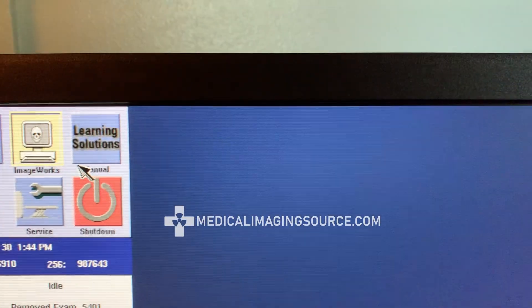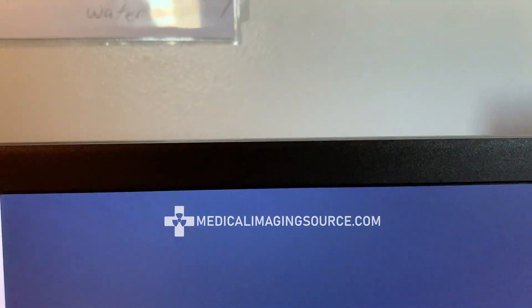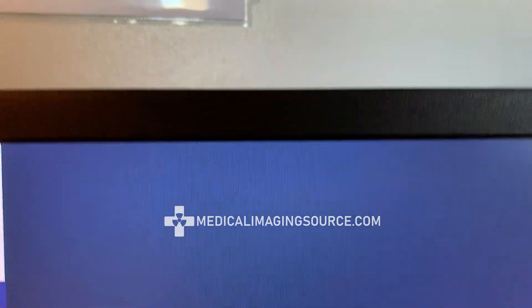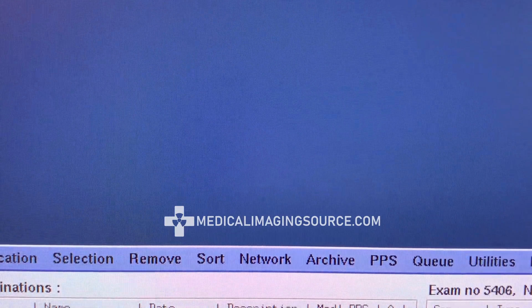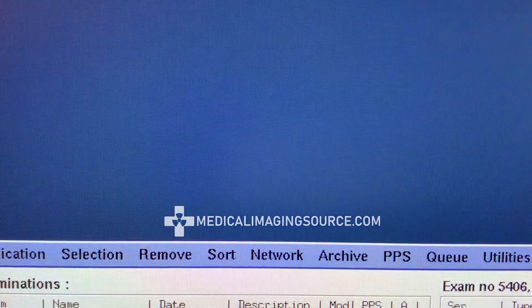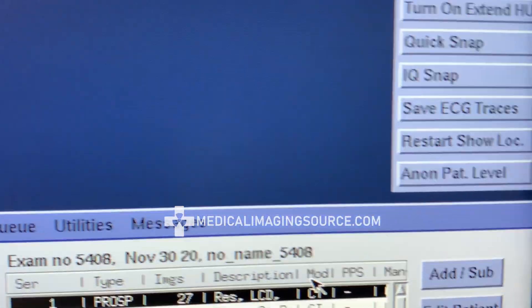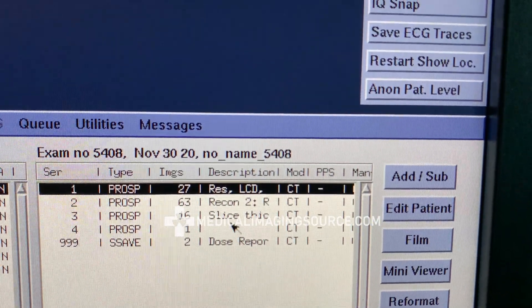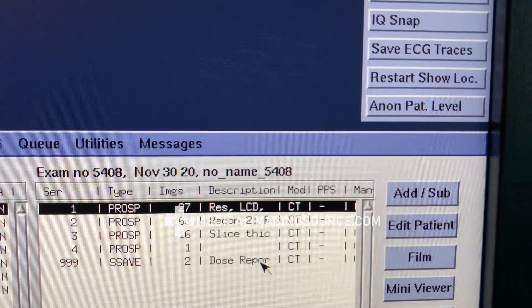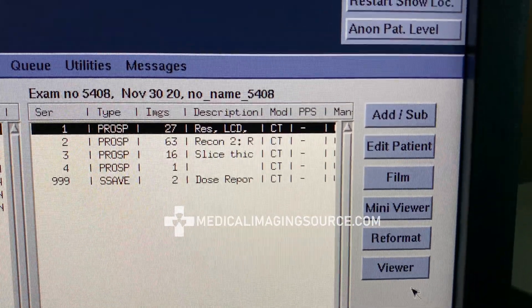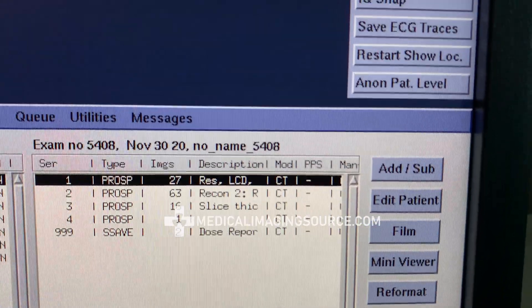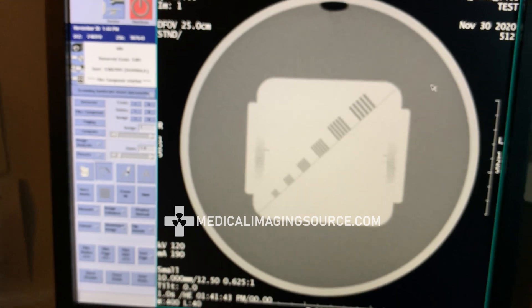That'll change our screen over to ImageWorks, and we can see our ImageWorks database right here. We can click on our top exam, and over on this side you can see we have our four series plus the dose report that's generated automatically. We'll come to Viewer here and that will bring up the program.